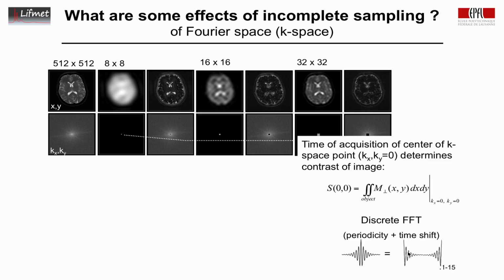So we've taken this half, shifted it to the left, and that half, as we shift, we fold it around and put it on this side. And we have seen before, for the Fourier transformation, that the signal at time 0 is proportional to the magnetization. Here's our time signal, 0. So this signal here is proportional to the magnetization, and therefore is proportional to equilibrium magnetization and the effects of relaxation.